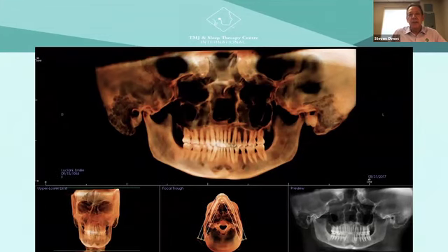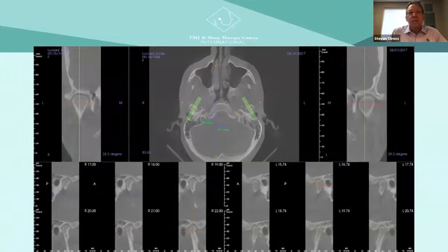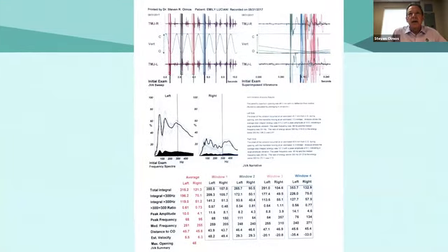So this is the panoramic view, OPG, and this is the view for the condyle-fossa relationships. And so you can see less joint space there in both instances. And so this is what a report looks like from a JVA, and you can see that there's a considerable amount of energy here. So this is the left joint, this is the right, and so we measure up this total energy under this, and that's called total integral.